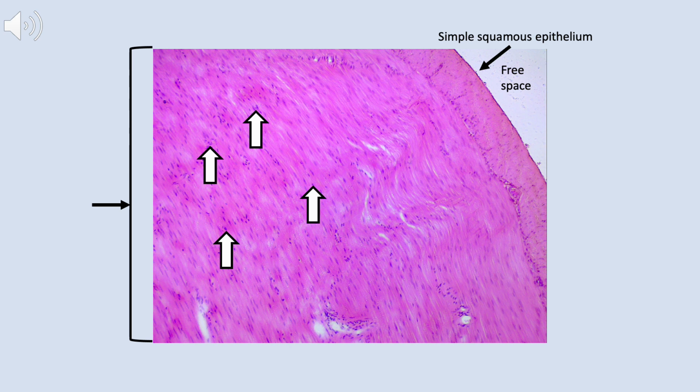We can also verify that by looking at the arrangement of the cells. In the small intestine, they're usually arranged where a layer will wrap around the intestine itself, almost like a watch band around your wrist, and then an outer layer will run down the length of the intestine like your sleeve runs down your arm. And that's what we're seeing, and I've indicated the difference between the two layers with that dashed line.